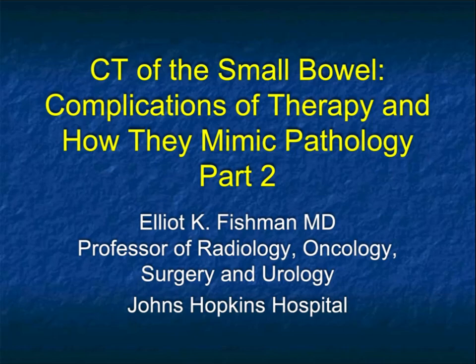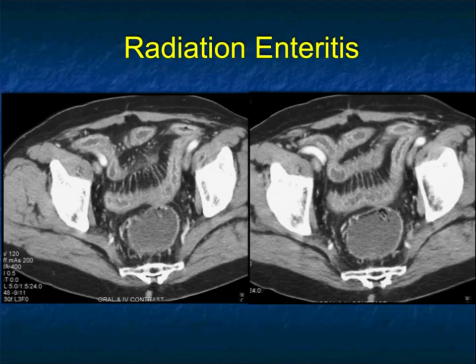In the first session, we spoke about several things, including chemotherapy. We spoke about graft versus host disease, and we just started to talk about issues related to radiation enteritis. Let's talk about that in more detail. I mentioned that radiation issues have been around for a long time, though they're less frequent. One of the challenges at times is to not overcall processes, so not overcall tumor recurrence when it simply changes related to the therapy like radiation.